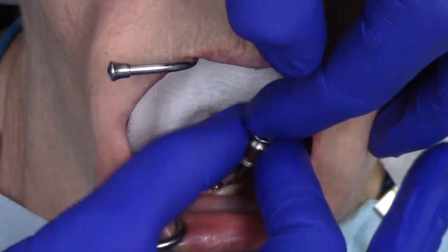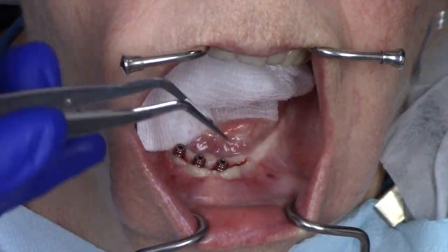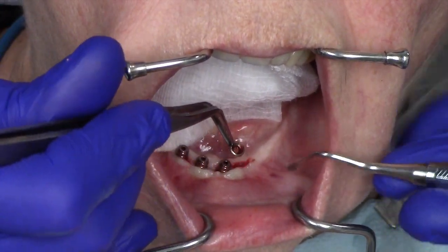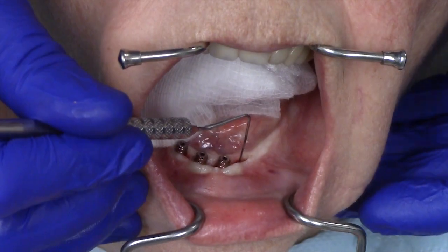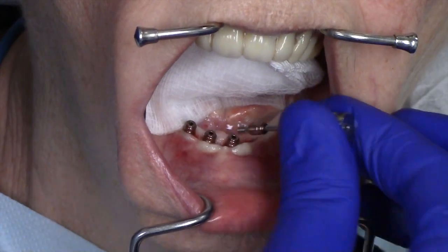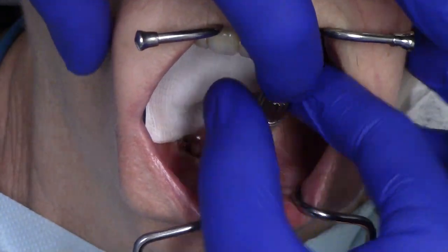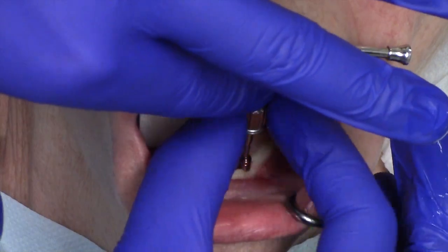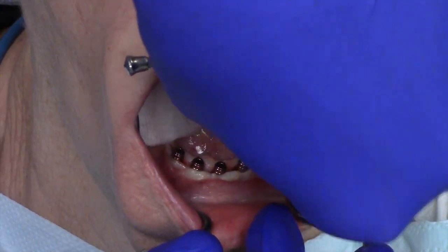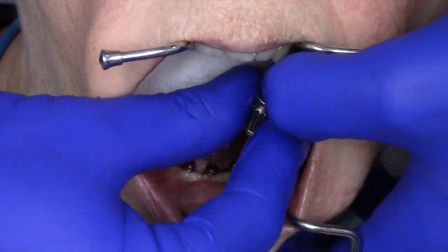If you use a non-platform switched implant, be careful because you might have to push some tissue out of the way while you seat the abutment. Continuing on to our final implant, I'm removing the healing abutment and using my tissue curette to carefully tease the tissue away from the top of the implant, followed by periodontal tissue height measurement and chlorhexidine irrigation. I place the locator RTX abutment that corresponds to my soft tissue height measurement, or tissue cuff. I am only using finger pressure to tighten the abutment to ensure they are completely seated on top of each of the implants.